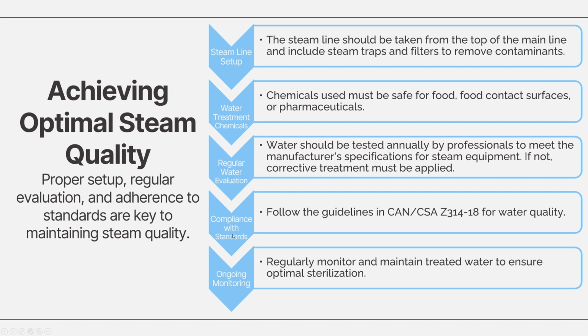And of course, complying with standards is very important too. They should align with what we call CAN/CSA Z314-18 for water quality. And this guideline actually outlines national standards for steam and water use in sterilization processes.